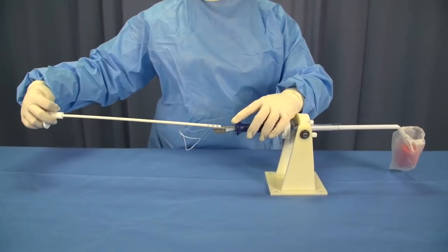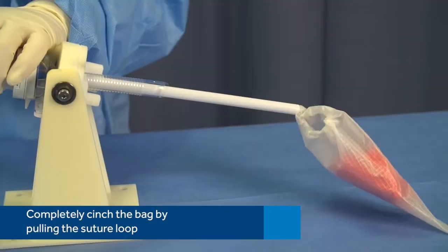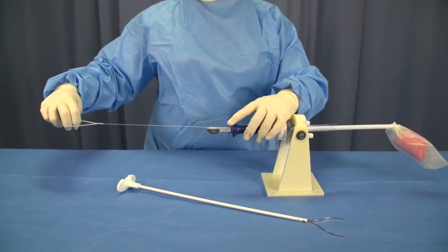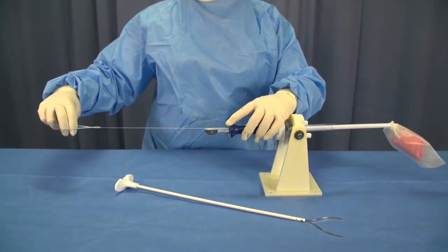Fully remove the fork handle from the device. Do not attempt to redeploy the fork handle. Completely cinch the bag by pulling the suture loop. When cinching the bag without forks present, use caution to avoid spillage of contents. The bag can be un-cinched using atraumatic graspers while inside the cavity.